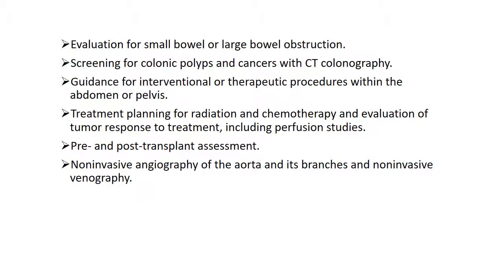So someone might have poor perfusion of their lower extremity. You do a CT angiography and it shows a blockage, and then along with that, you might end up then having a catheterization, basically heart catheterization, that ends up going to the peripherals so that the cardiologist or interventional radiologist can do balloon and stenting, or they might do a bypass surgery such as a FEM-POP bypass, which is a pretty common procedure. And also helps to rule out in a non-invasive way any blockages that might be occurring as well.